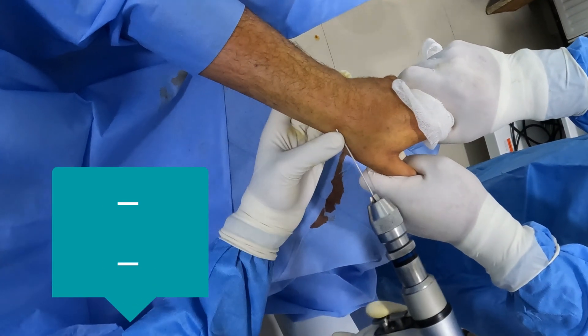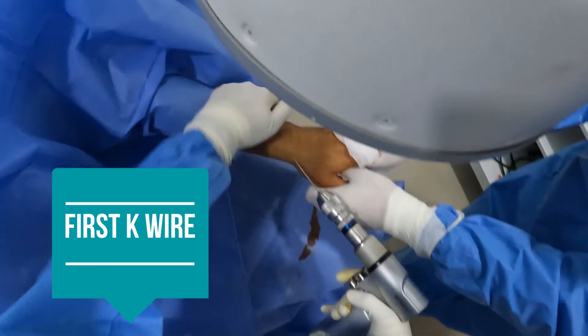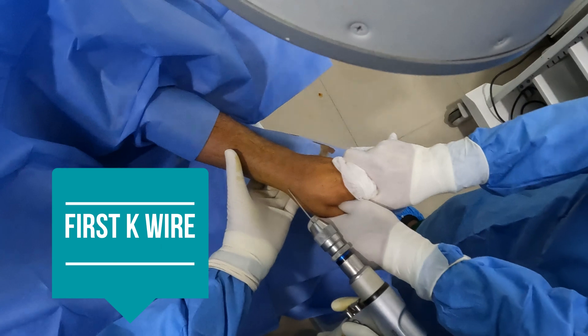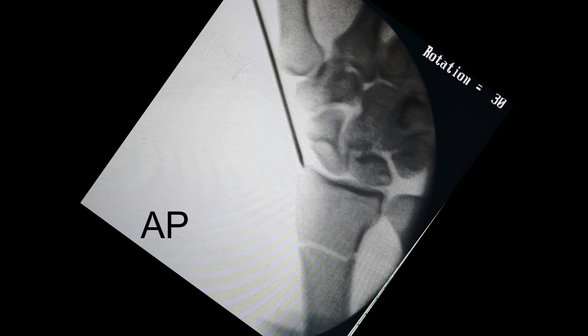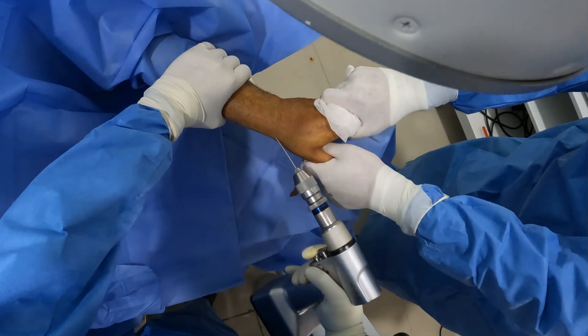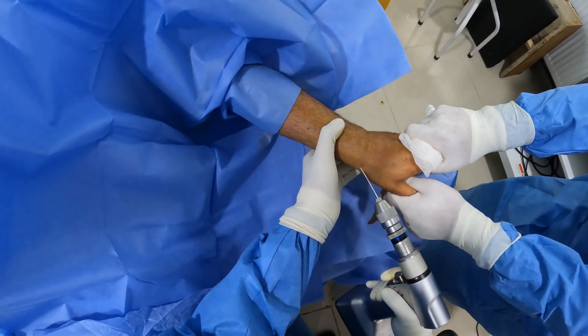I'm taking a 1.8 mm K-wire. The first K-wire I'm going to place is at the tip of the radial styloid. I'm palpating the radial styloid, entering just distal to it. My assistant is again giving some ulnar deviation so that I get the offset. This is the C-arm view of the starting point of my K-wire, and once it has been confirmed, I'll start.